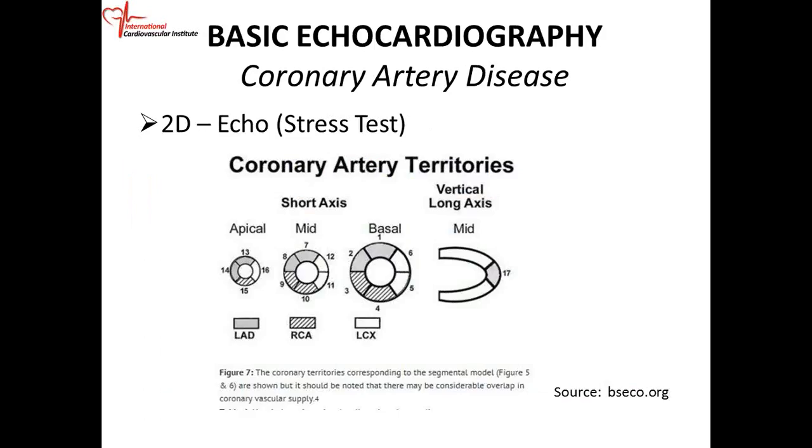You have to get a baseline or resting blood pressure. And it's good to talk to the patient, make sure the patient is not having any significant chest pains or significant shortness of breath before you do the test.